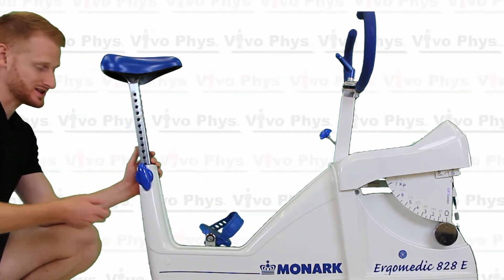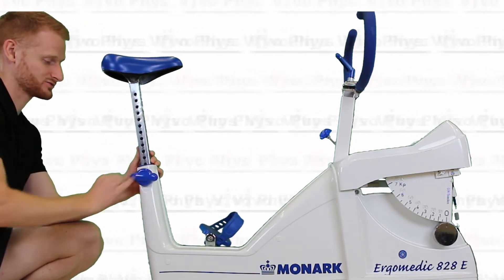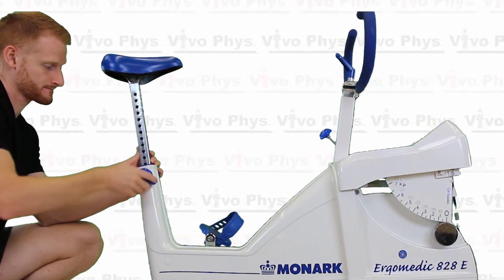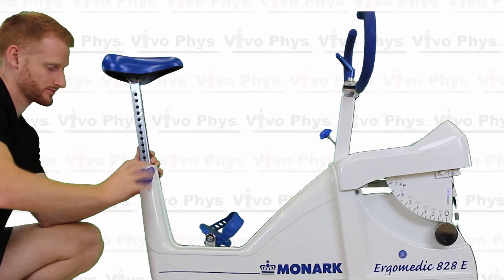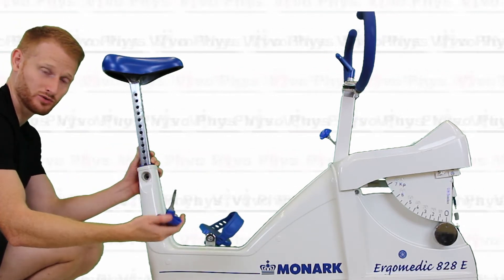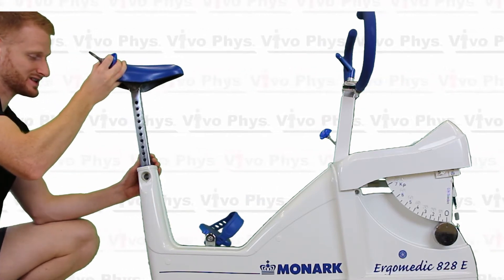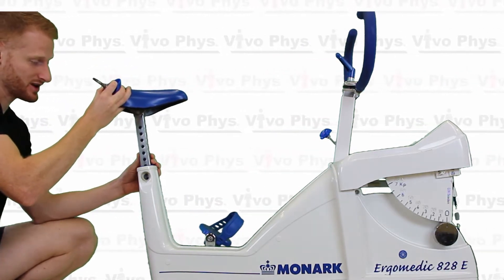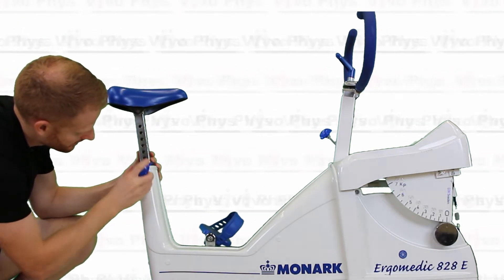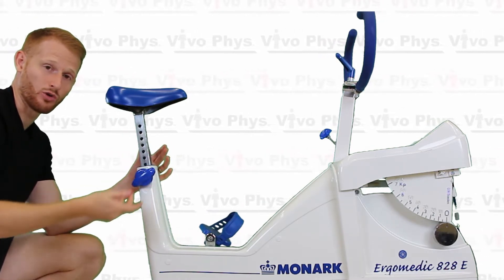In order to adjust the seat height, you're going to take this blue bolt here and you're just going to screw it and it's going to come all the way out. It's an actual bolt, so you literally want to take this bolt completely out and then you can adjust the seat height either up or down. Make sure that when you go to put it back in that you get it into a hole and that you just screw it back in all the way.